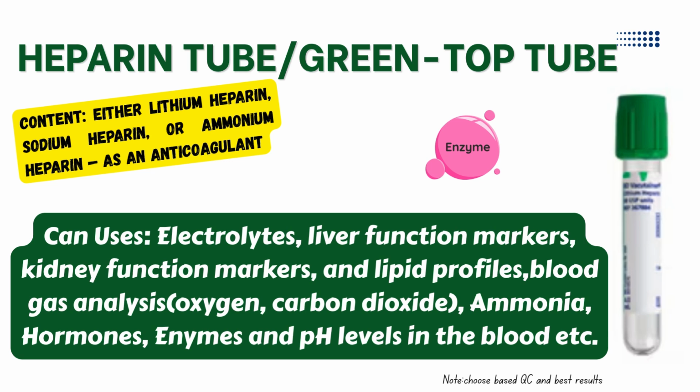Heparin tube, green top tube. Content: either lithium heparin, sodium heparin, or ammonium heparin, as an anticoagulant.